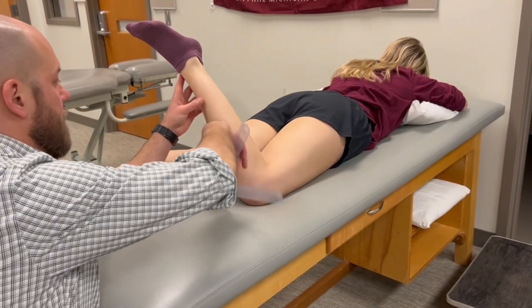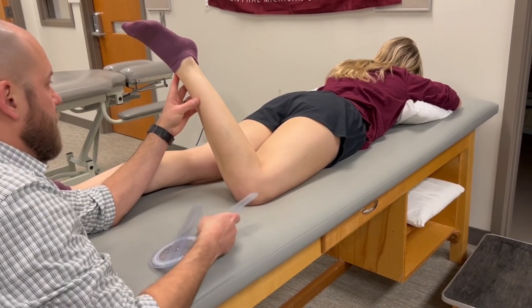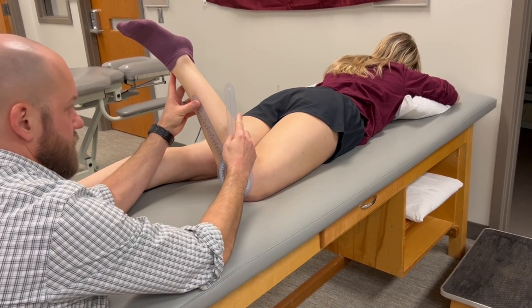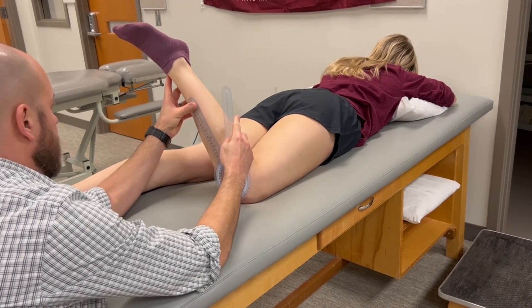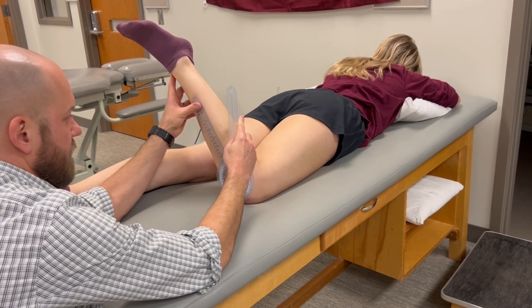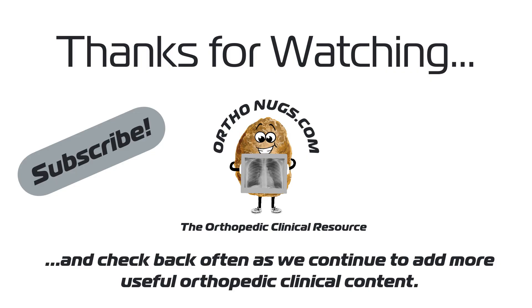I can come around, take an estimate of about 40 degrees. My reference is going to be parallel with the vertical line of gravity, and the indicator is parallel with the anterior midline of the leg.